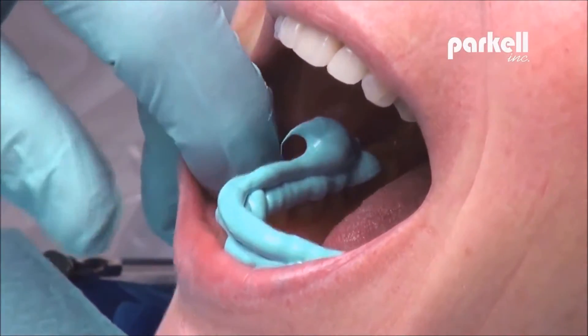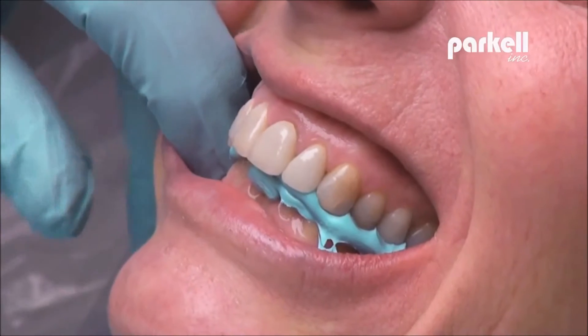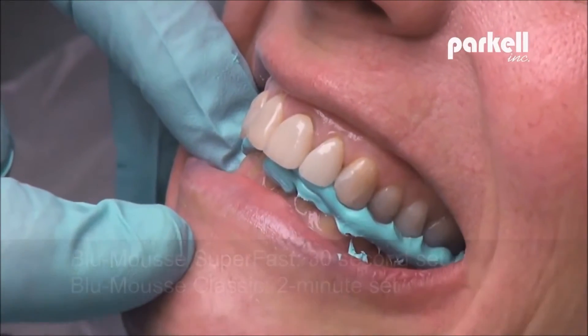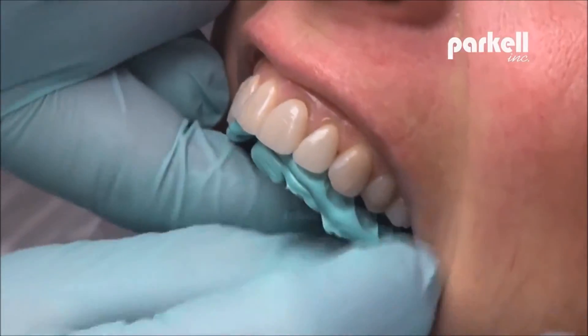Have patient bite down firmly, check that landmarks line up, and hold until set. Remove from mouth in one quick motion.